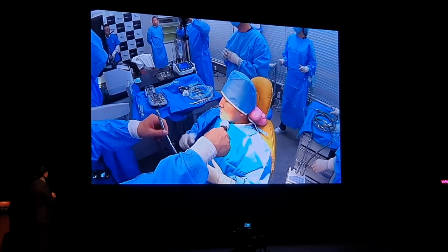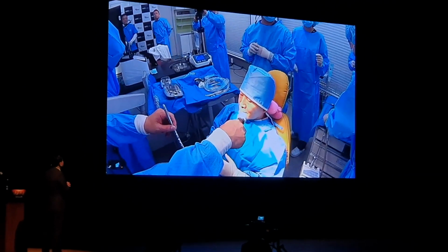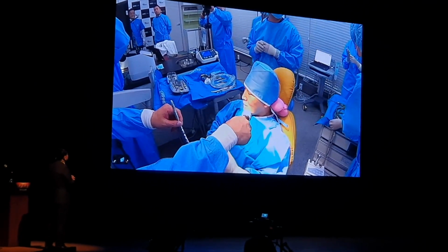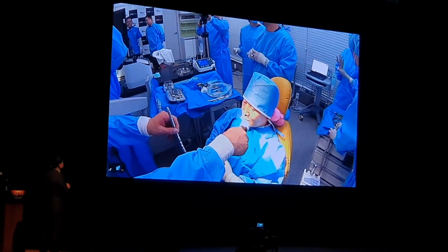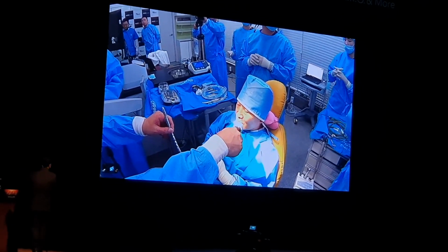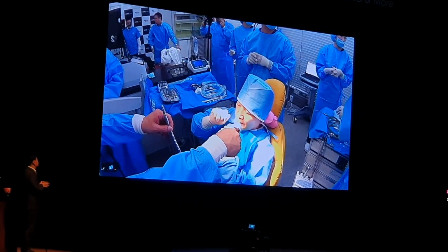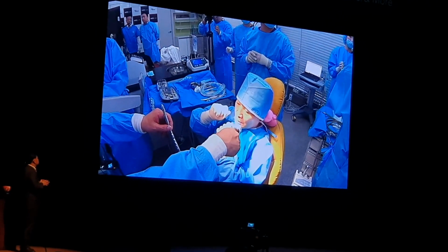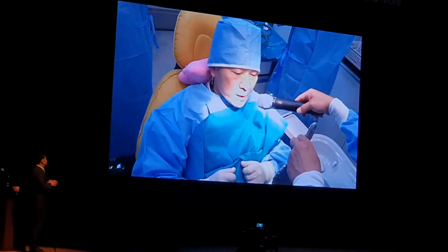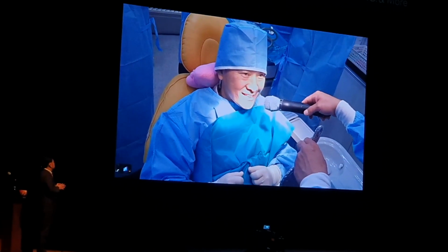So is everyone ready back there? Oh my God. Is it ready yet? A few more minutes. To be honest with you, I'm a little nervous, but I'm familiar with using mirrors. So I think I can do the drilling myself looking through the mirror. And I know the VARO guide will guide me along the way, so I'm not too worried about it. I'm sure it's an unusual image.